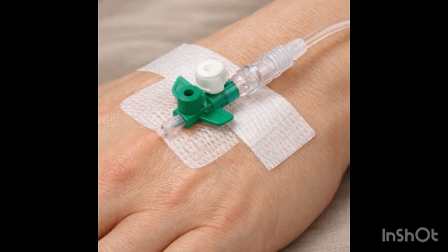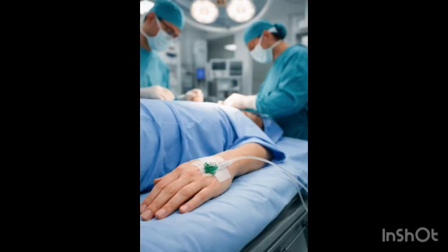So, the equipment we need: gloves, a tourniquet, a cannula, and at the same time we need chlorhexidine or alcohol soap to clean the area. From the patient's point of view, you need consent from the patient, and you need to ask whether the patient has any allergies prior to performing the procedure. You also need to make sure that the patient is comfortable and warm.